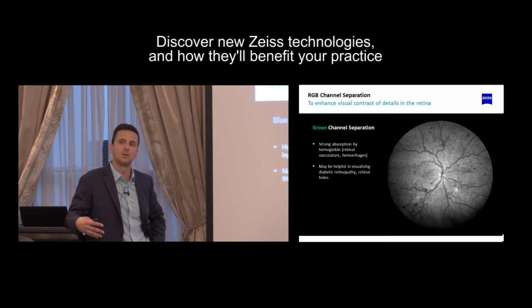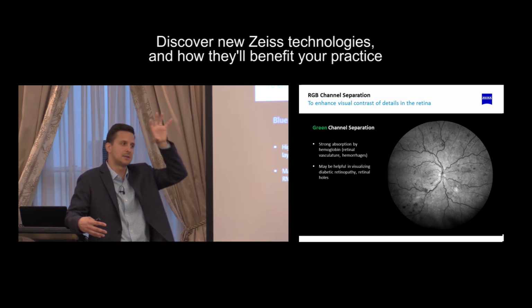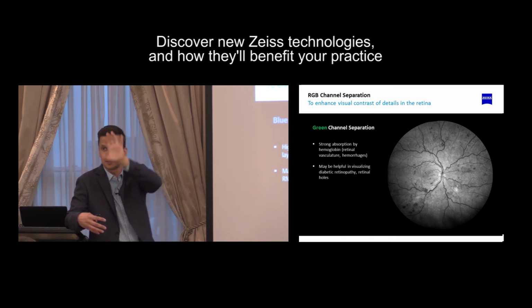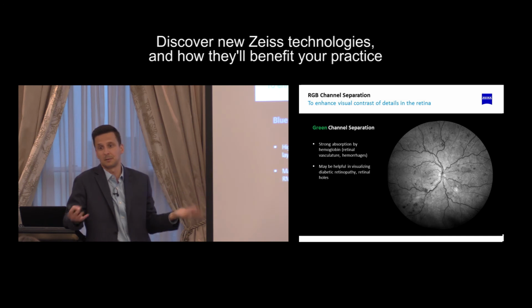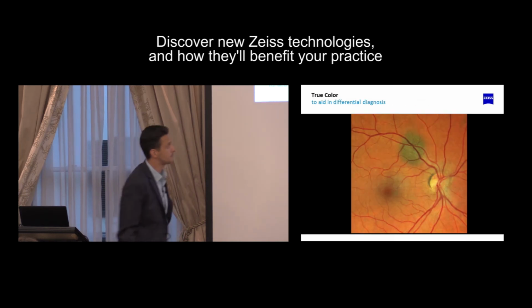Now, if you have something like Forum, where you can take in glaucoma workplace, you can take an image of your nerve, and you can take your visual field. You could actually put this blue on there and look at RNFL changes on that photo adjacent to where the visual field changes, and corroborate or correlate data and information around a diagnosis of glaucoma. So this can be another useful piece in that regard.